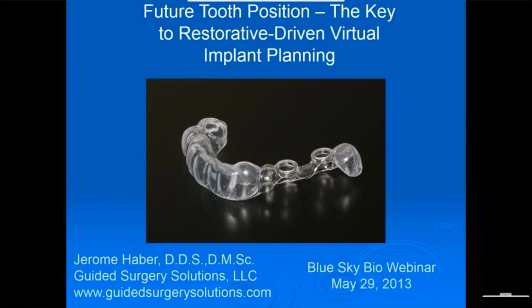As we all know, guided surgery is all about the fundamentals of treatment planning and is dependent upon an accurate surgical plan. An accurate surgical plan is dependent on visualization of future tooth position. The drill guide will deliver a hole where you aim it. The challenge is to create a surgical plan which aims the guide correctly. To meet this challenge, virtual planning software must include the necessary data for visualization of future tooth position.